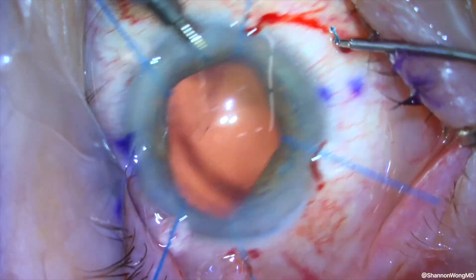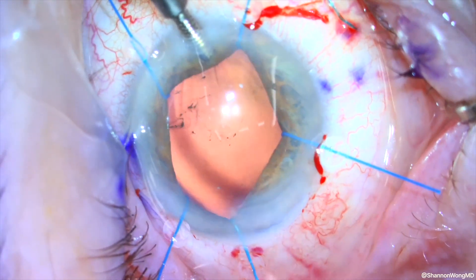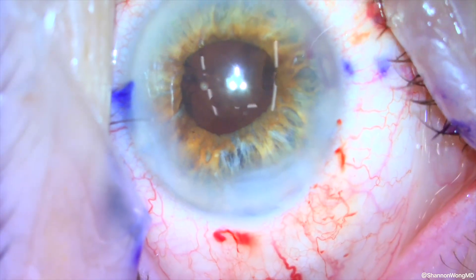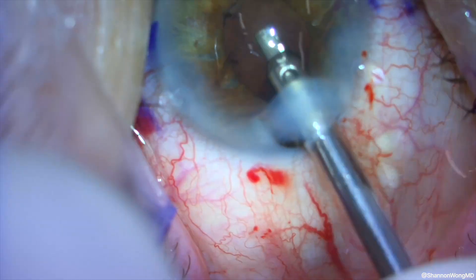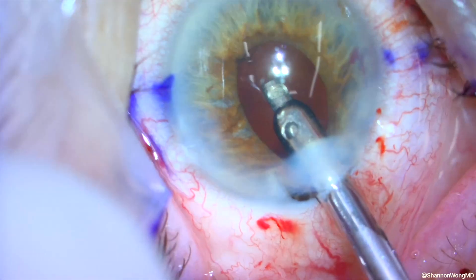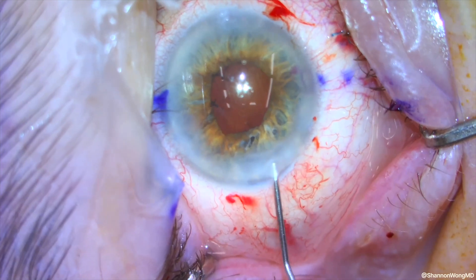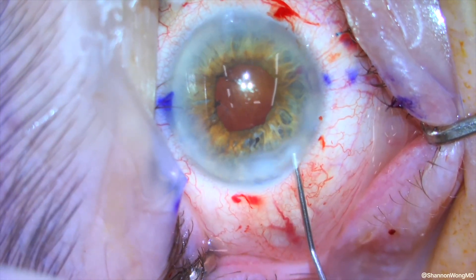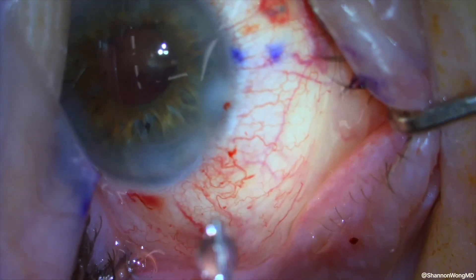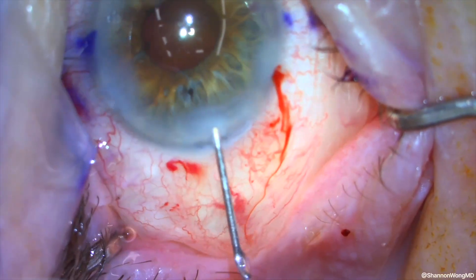We now have a situation where we can no longer see the optic of the lens, and the implant is only hanging on by the right haptic. We try to bring the optic into view by maneuvering the right haptic. When our patient becomes uncomfortable, we choose to remove our iris retractors — we can now see the optic of the lens. An aspirating instrument is used to remove viscoelastic. Iris prolapse is encountered and managed immediately. Due to patient discomfort, a unicameral eye, and growing concern about suprachoroidal hemorrhage risk, we elected to bury the right haptic into the sclera, stromal hydrate all incisions, and conclude the case.